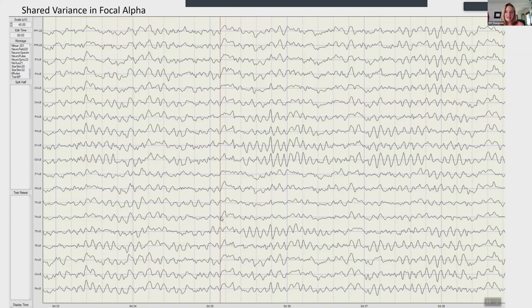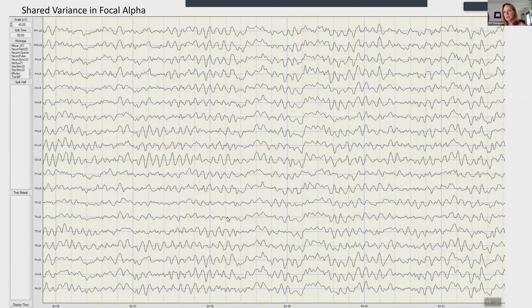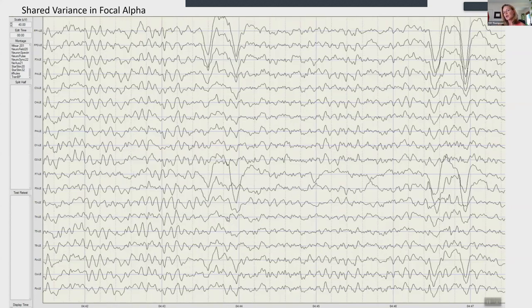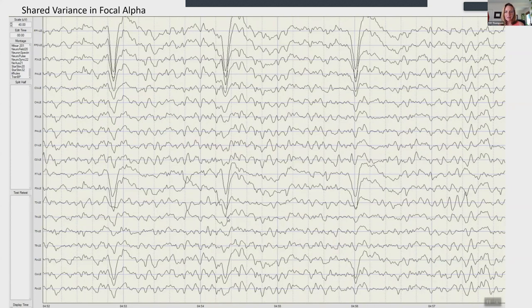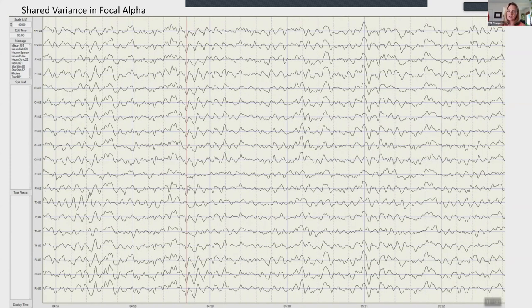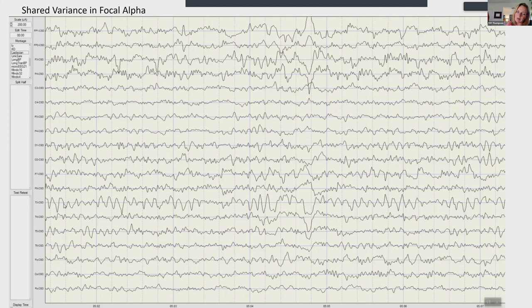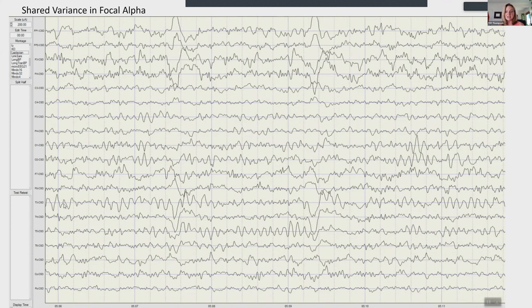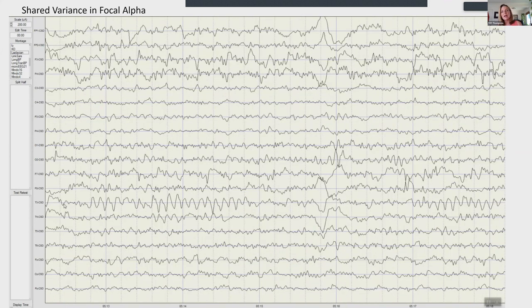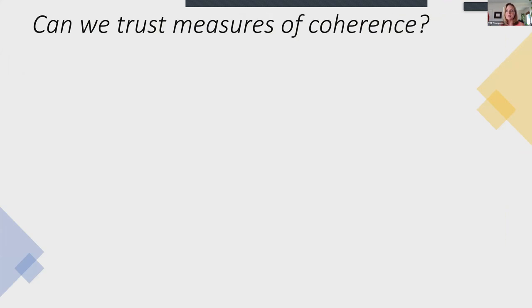Here's a favorite example: an 'alpha head' — someone with a ton of alpha in their data. You might think they're really a dreamer, but what's insidious in alpha records is shared variance. Because the alpha comes on and off, it's not 100% of the time that everything moves in lockstep. So we alter the montage and go to a Laplacian, which pulls things out focally. The Laplacian reveals it's actually a T3 focal alpha — maybe a touch at T5 — indicating temporal lobe alpha, which suggests frontal lobe disengagement and is one of the ADHD profiles.